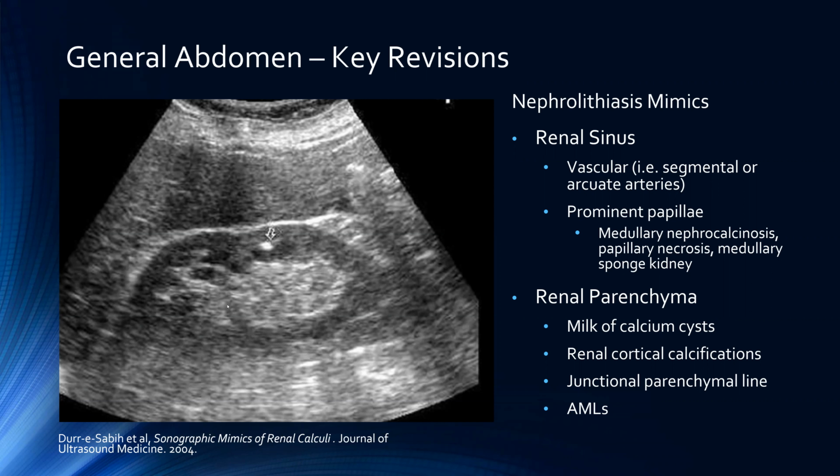If there is vascular calcification, that's going to complicate matters and pretty much make it impossible to differentiate. But vessel location, configuration, as well as the lack of posterior shadowing should suggest a vascular entity if that is the case and there isn't any associated vascular calcification.